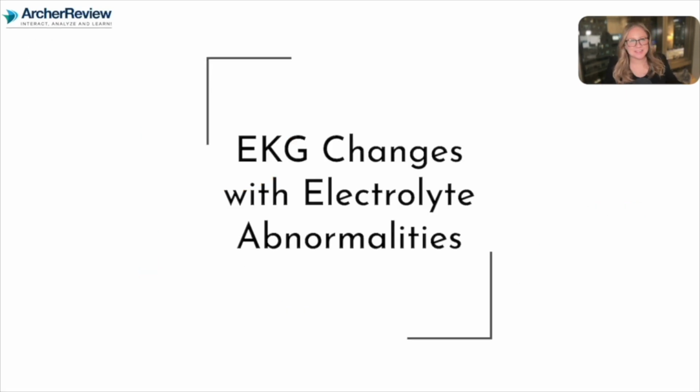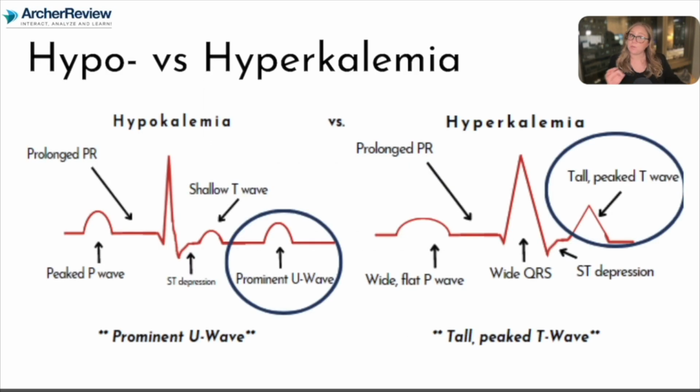All right, nice work, Archer nurses. That's all I have for you on your EKG changes that occur with electrolyte abnormality. Here is a quick recap of the top points you need to remember for your NCLEX. First, in hypokalemia, we see a prominent U wave. In hyperkalemia, we see a tall peaked T wave.